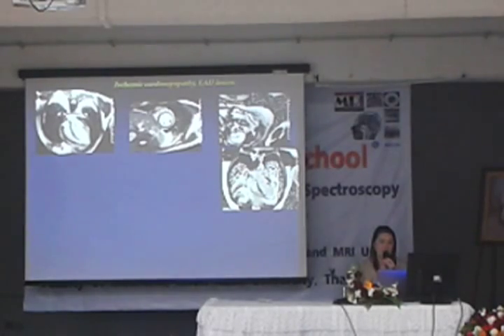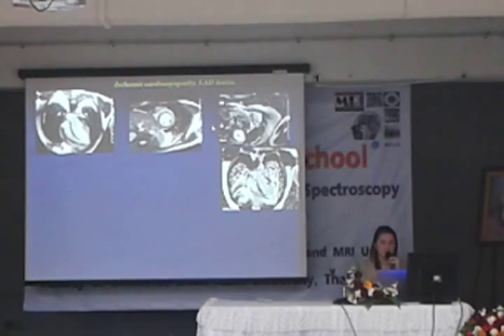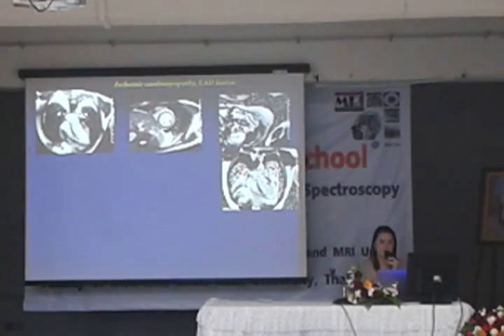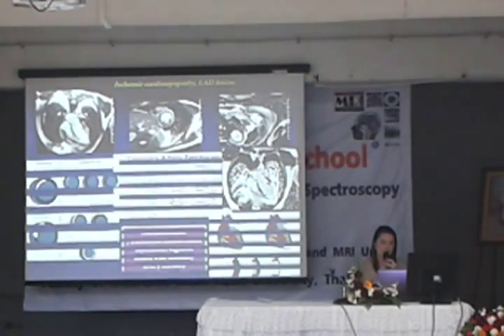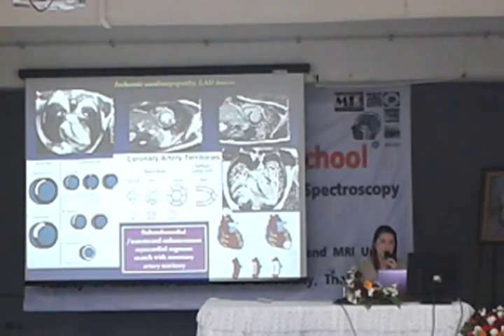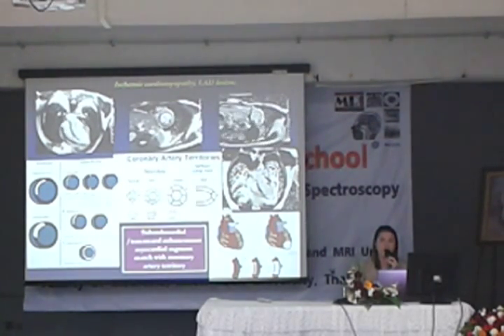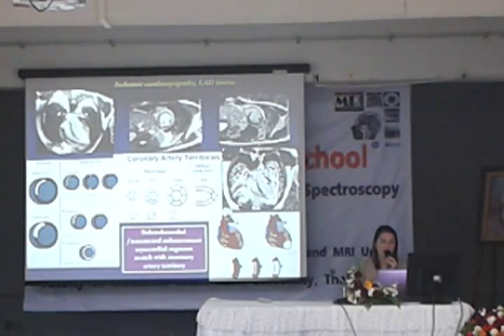And this example case is ischemic cardiomyopathy, or this patient has myocardial disease caused by coronary stenosis, and we expect that this patient has an LAD lesion. How do we know that? According to the principle that I described previously, in the white blood image, you can visualize that the anterior and anterior septal wall of this patient has less movement than the other segments.